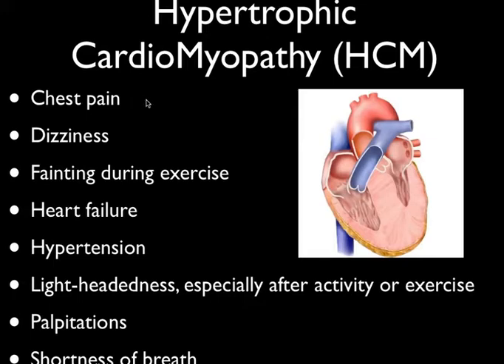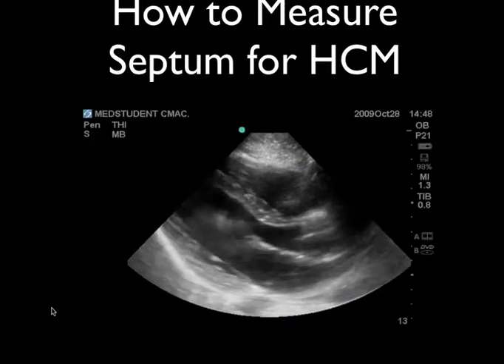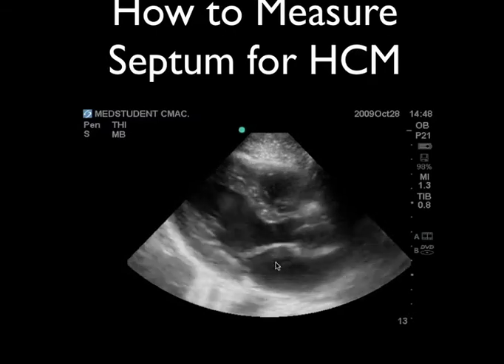So patients who have hypertrophic cardiomyopathy can have all kinds of non-specific types of symptoms, and none of these really point exactly to the diagnosis. It's just, lots and lots of different things can cause all these things. And so that's why you end up turning to imaging to help you with your diagnosis. Now, this is a patient here who does not have hypertrophic cardiomyopathy.